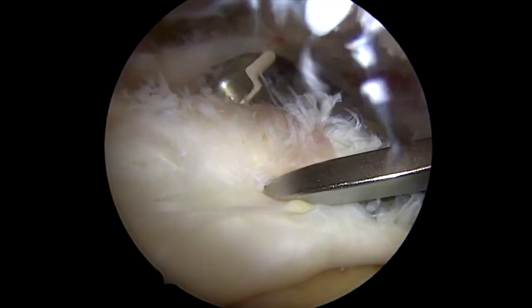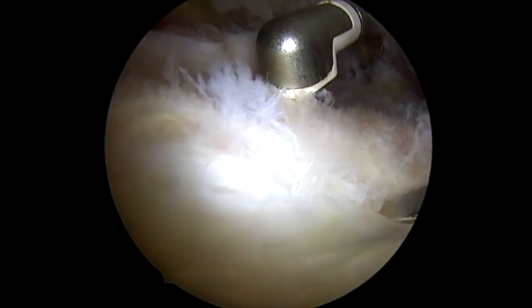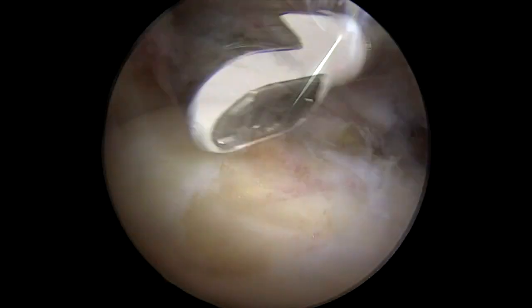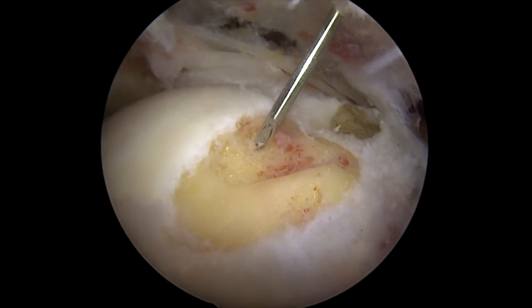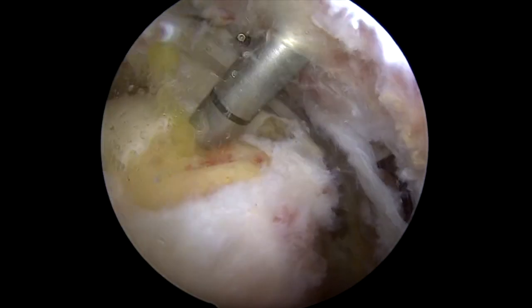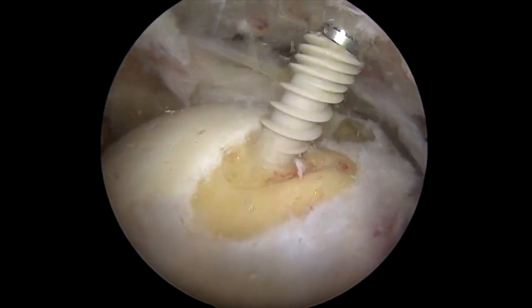Then what I'm going to do here is make a little mark in the tendon so I know exactly where the sutures are supposed to go — so I know where the full tendon attachment is. We'll then place anchors, and these are little plastic headless screws. First we punch a little hole in the bone, and then place this screwed-in anchor.